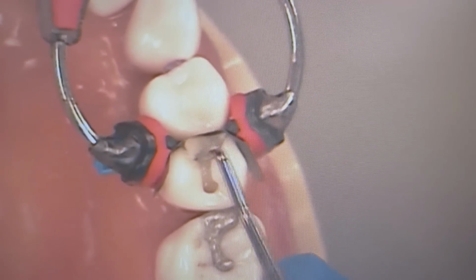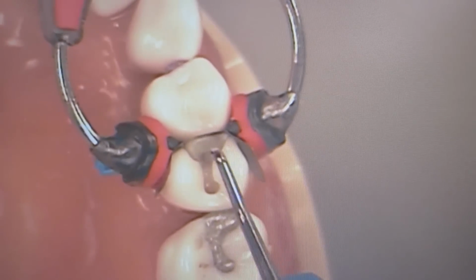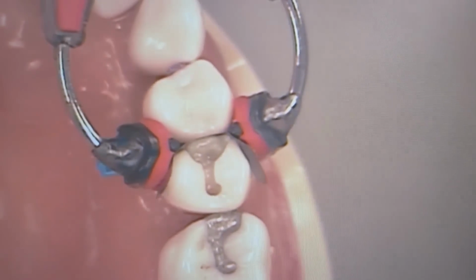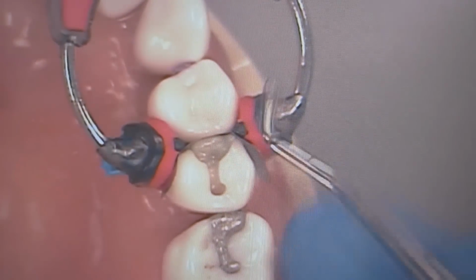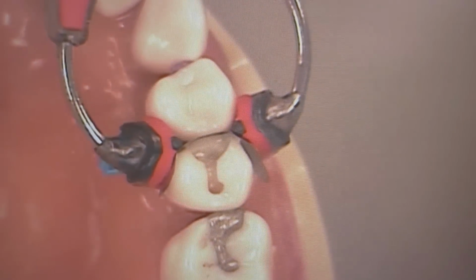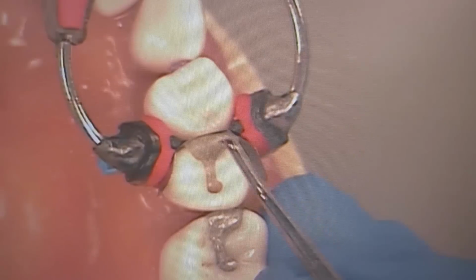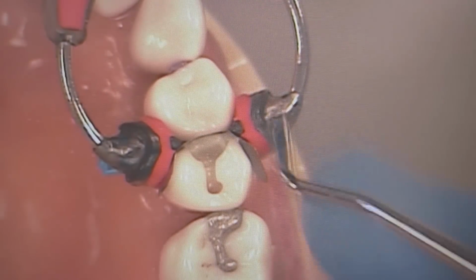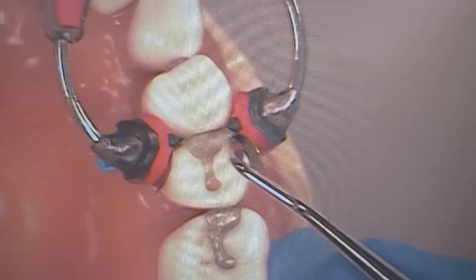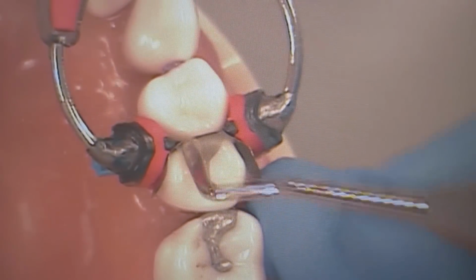Before he put it in, he rolled it into a caterpillar type shape, a hot dog type shape. Very cylindrical material into the marginal ridge. So is that up to the marginal ridge already? Correct. This is the third layer, shaping the marginal ridge. He shaped it into a hot dog before he put it in, which has worked for some of y'all, and other times it literally looks like a hot dog sitting on top. So just like we said, blend it.